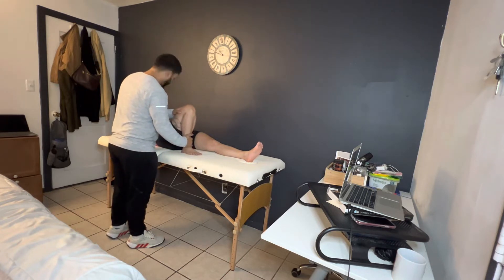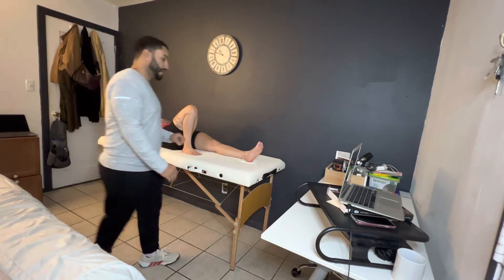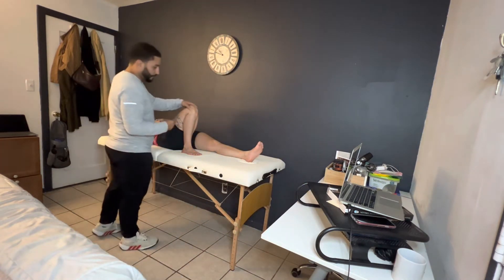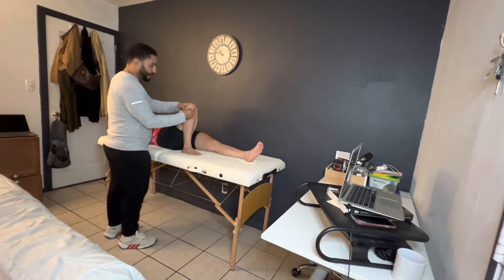I'm going to go ahead and leave your foot right here and measure the range of motion that we have in our knee. I'm going to go ahead and grab my goniometer and place it right here on the lateral epicondyle of our leg.